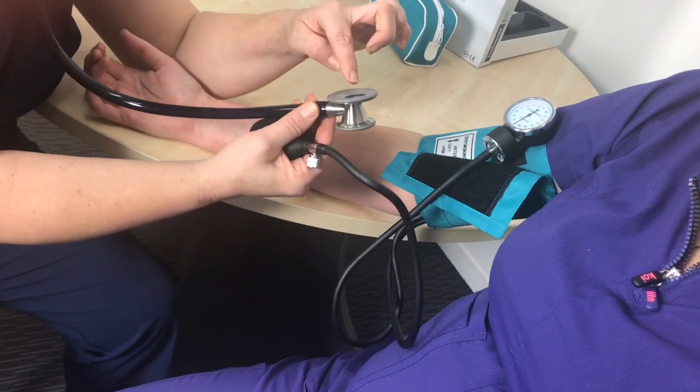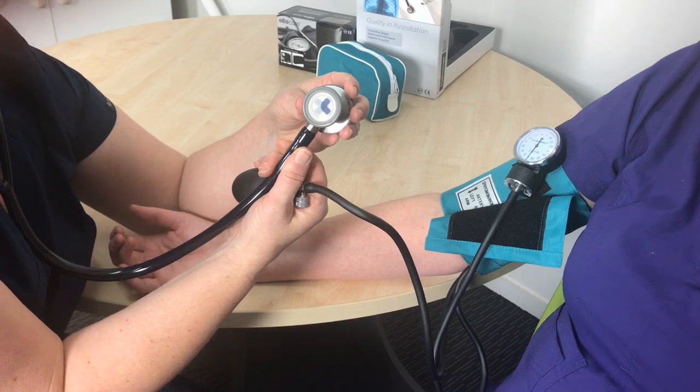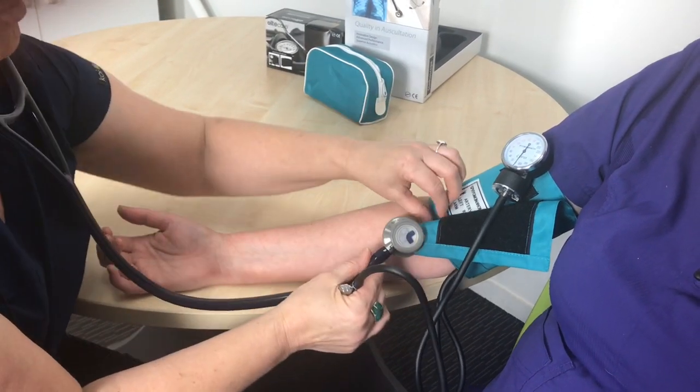Make sure the valve is turned all the way to the right, and make sure your stethoscope is on. Remember that the dual-head stethoscope has two directions it can turn — give it a light tap to let you know whether it's on.